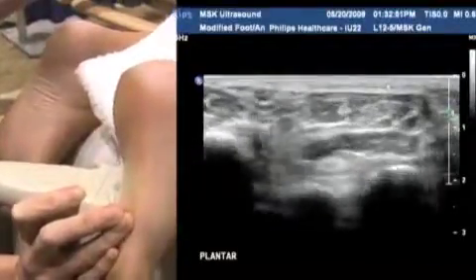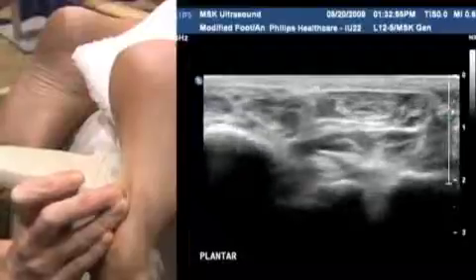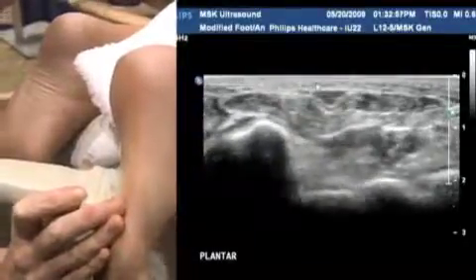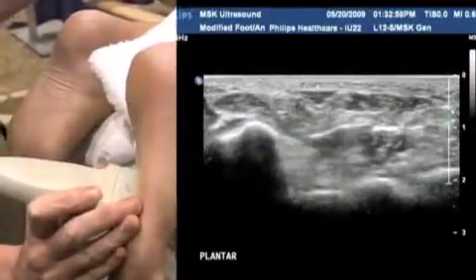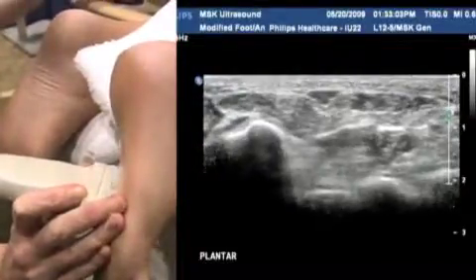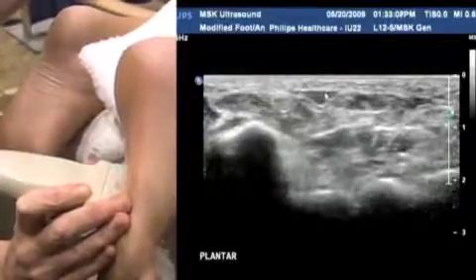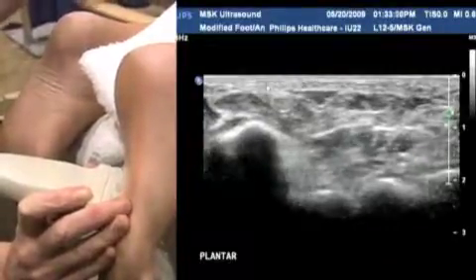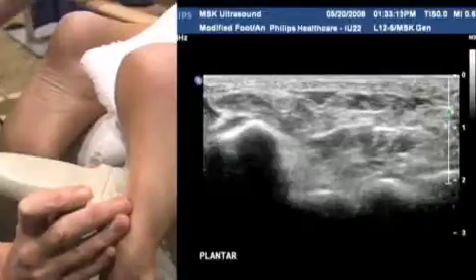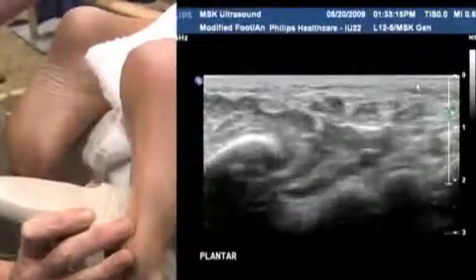Until we get all the way down towards the toes, and you can see how spread out it becomes. So it's really important to make sure as you assess, particularly in this transverse section, that your eye scans all the way medially to all the way laterally and doesn't just stay focused on that central portion of the plantar fascia, because you can have quite extensive and distal fibromas sitting right out either side. So it's really important to be aware of that.